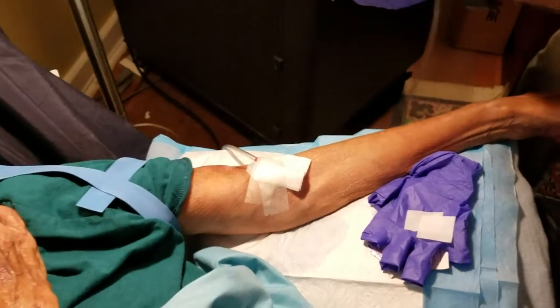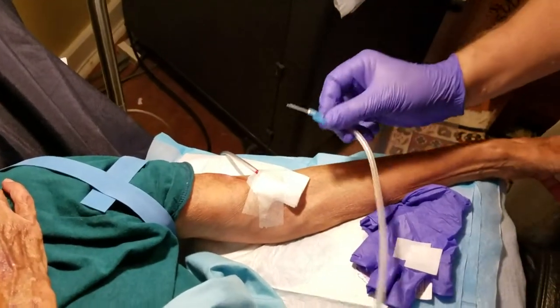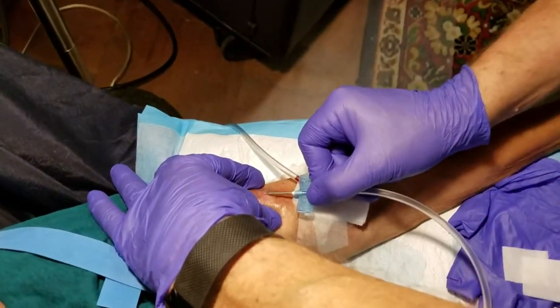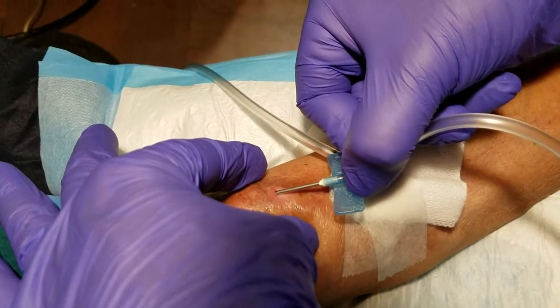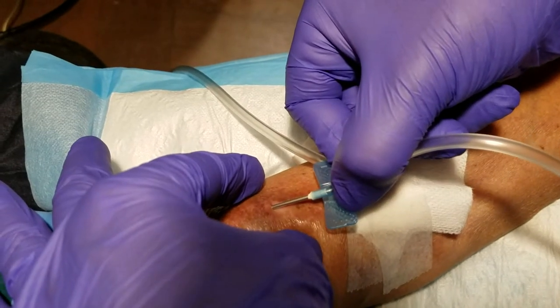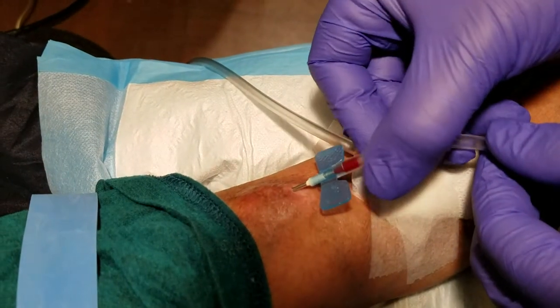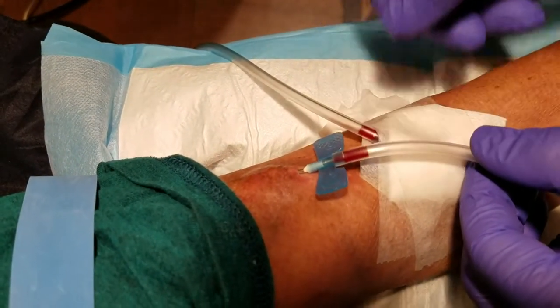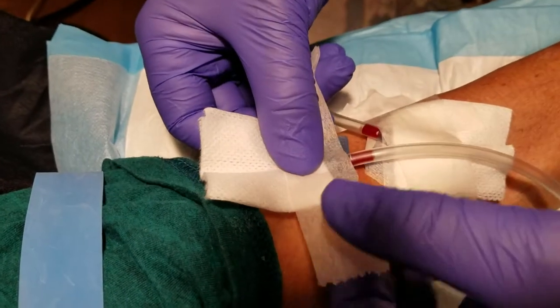Now we're gonna do the venous. The venous is very slight. You can see the hole there, and I just barely get it underneath the skin, and just gently move it in. And there's already — you see the flash.